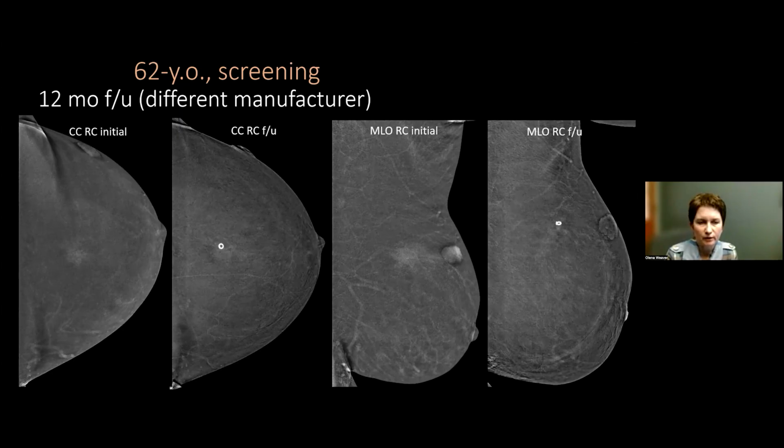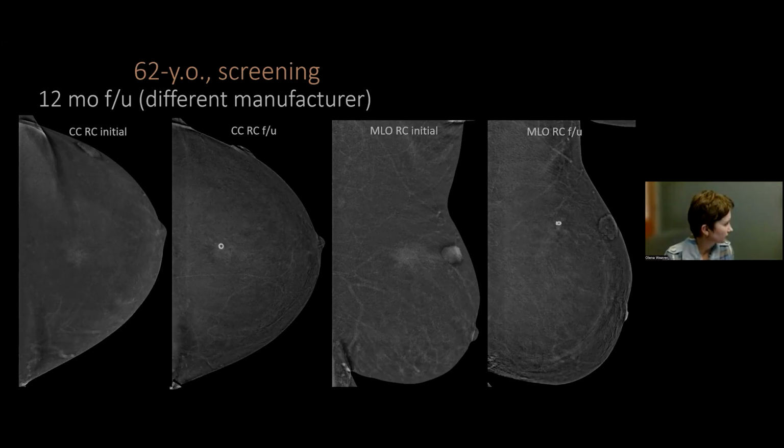And just for you to notice, in the left breast, in the upper outer breast, there is a skin mass. It's one of those cutaneous hemangiomas, but a larger one. It has been stable on multiple prior images. So right here, you can see an enhancing mass right on the skin surface. So another example of an enhancing cutaneous mass.